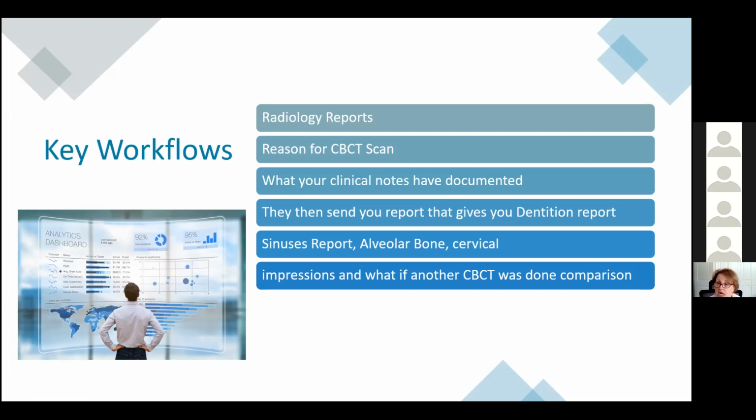And a lot of doctors, ENTs, for instance, may not have an available CBCT scan for their use in their office and may refer to you, but they have to come with a written prescription. And that is important for you to have within your own practice. You need to write a prescription as to why you feel a CBCT scan is important for your patient.